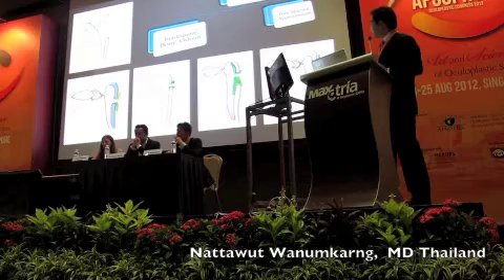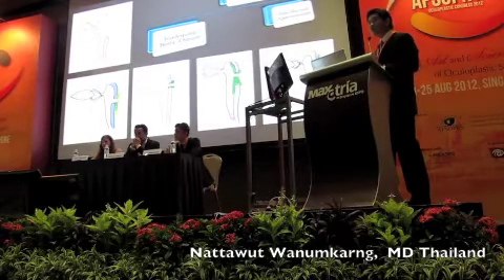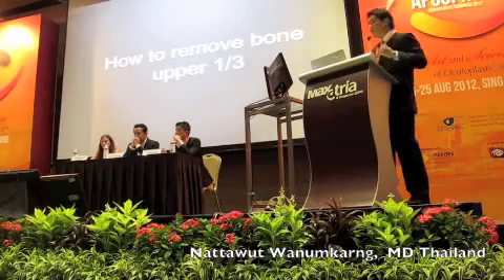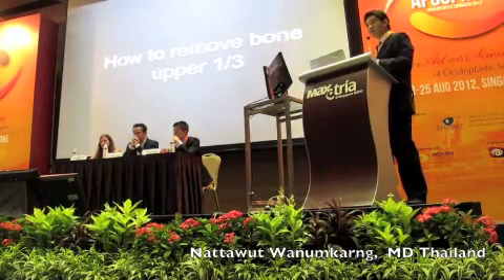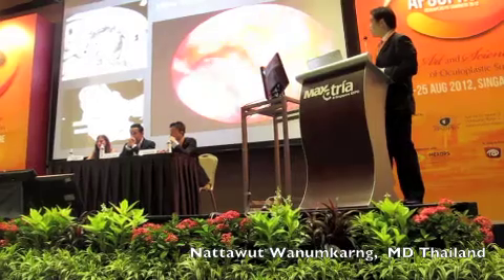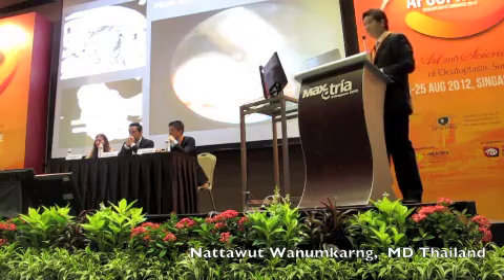The other important thing is the upper one-third of the bone. If you do not remove this one, you are going to get approximately 5% to 10% that fail. I will show how to remove the upper one-third. The lower two-thirds can be removed easily with the Kerrison punch. But the upper one-third — for the beginner, most surgeons may miss it or have a difficult time removing it.